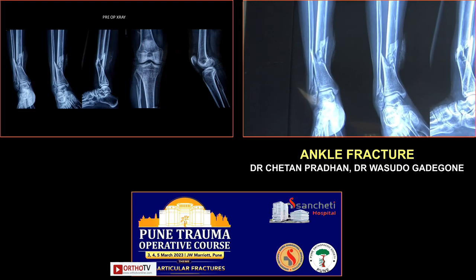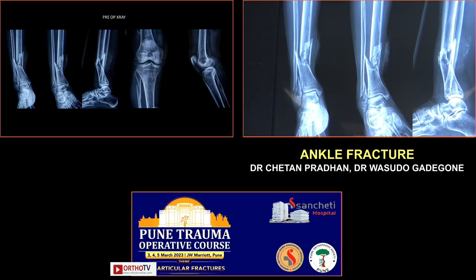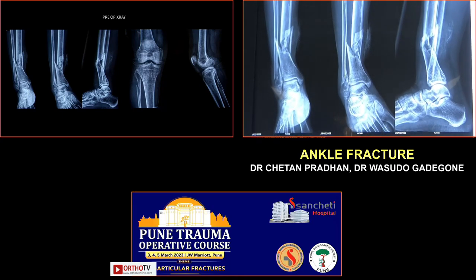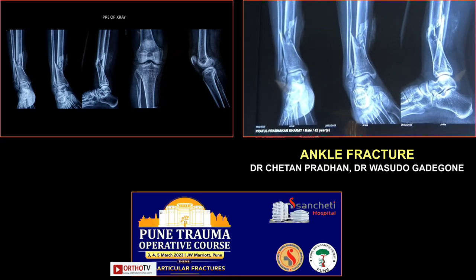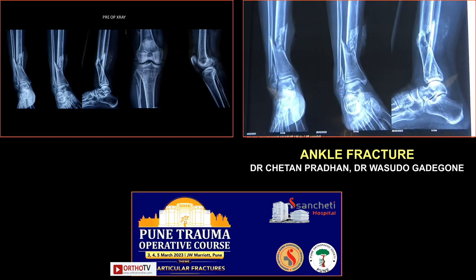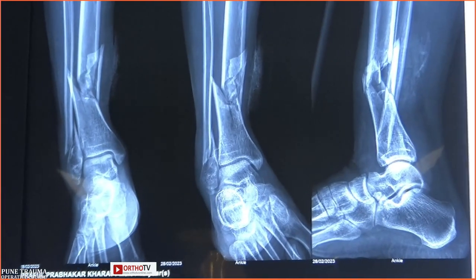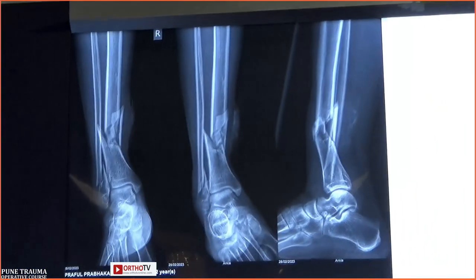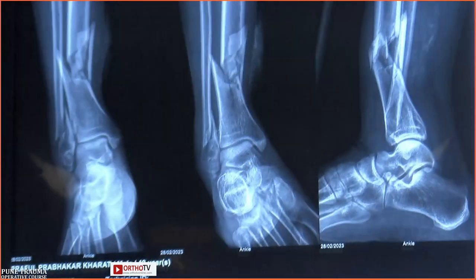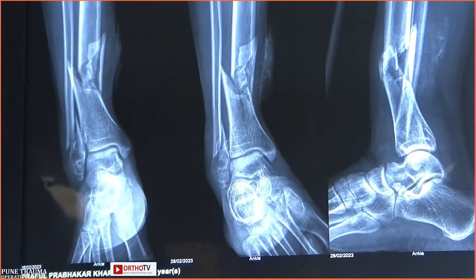Compound grade 1 or 2? Sushrut, you are not audible. Chetan, I have got a question to you. If you fix the fibula, when you try to get the reduction for tibia, you are planning to do nailing. Sometimes you lose the fixation of the fibula. So, I would rather put the guide wire in the tibia first, then fix the fibula, then go back and do the nailing of the tibia. That's what I normally do.